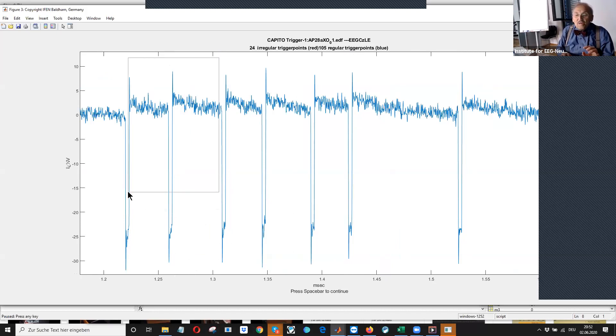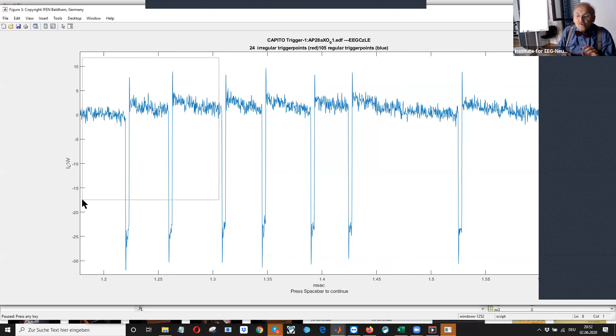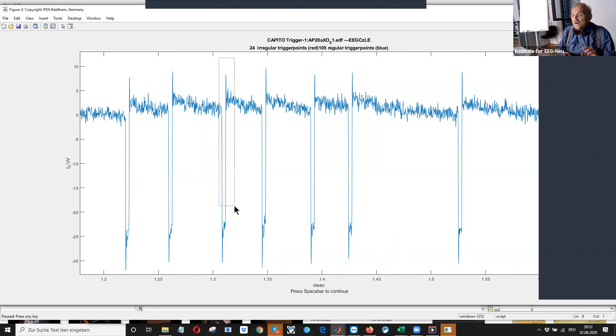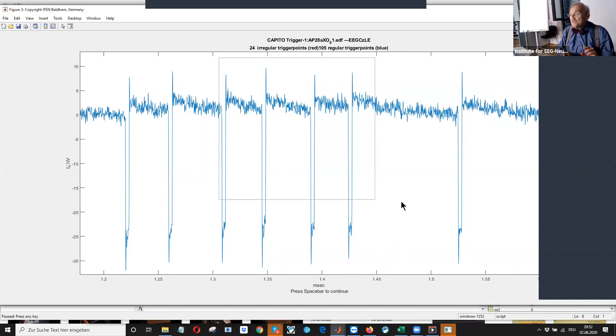And I set the trigger level to minus 20. So it was a very clear, nice, sharp trigger.